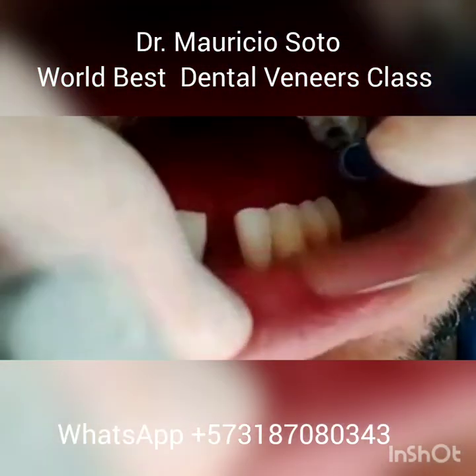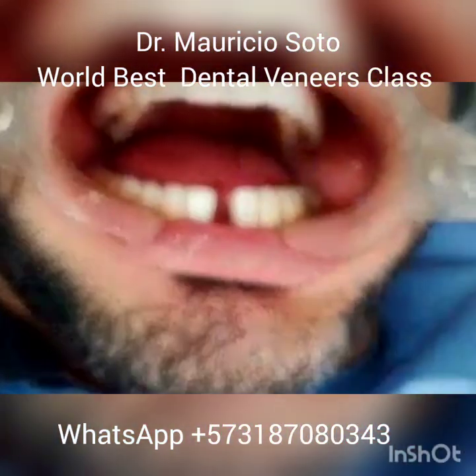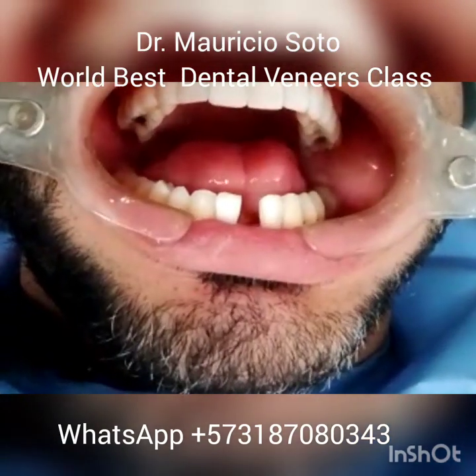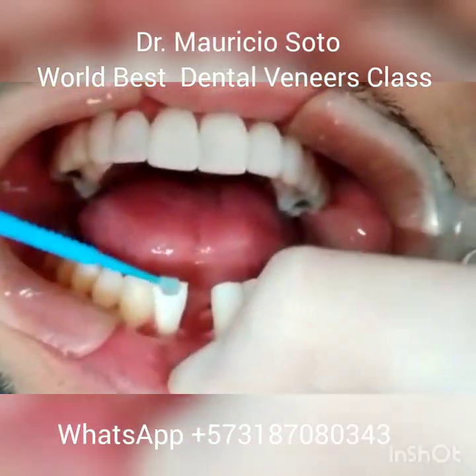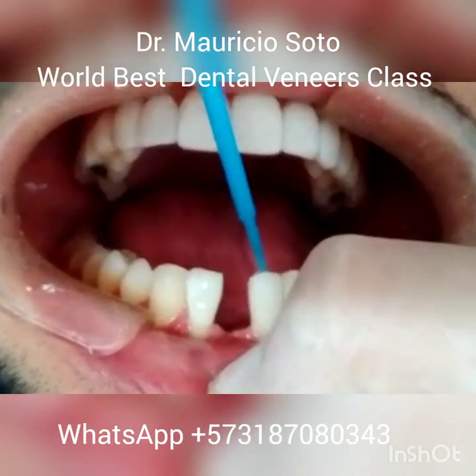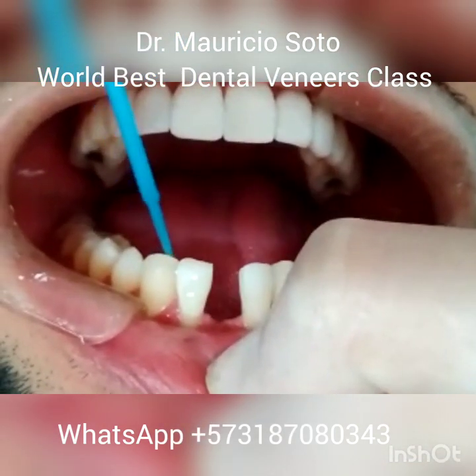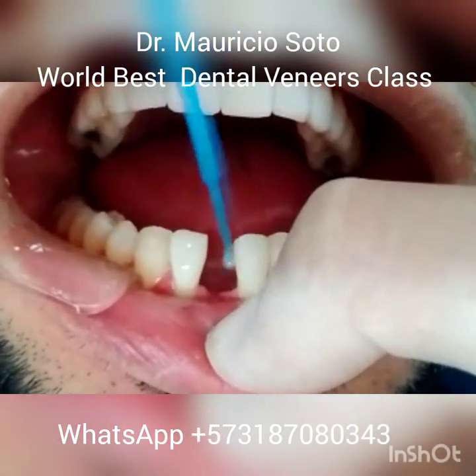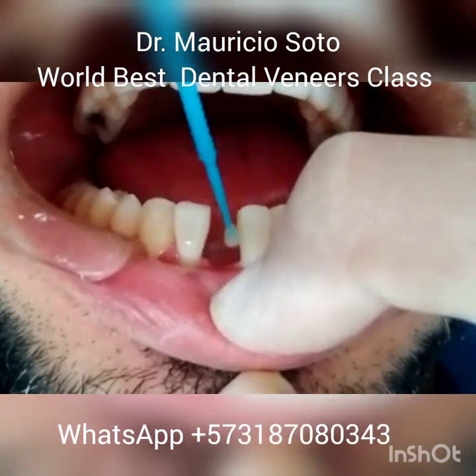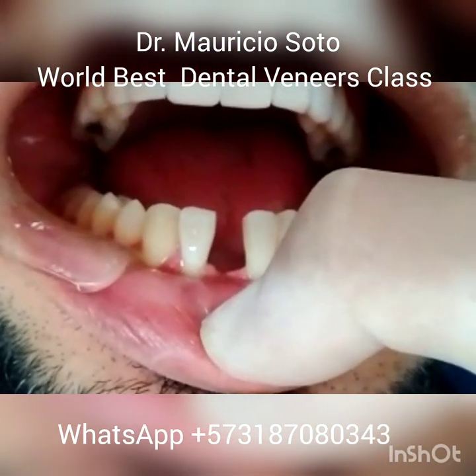After this, wash very well and dry. Your teeth are ready to bond the fiberglass. Now we are ready for the application of the bonding agent. Apply very well on all the surfaces, all the etched surfaces. You need to spread it very well on the surface of all the teeth to be bonded.